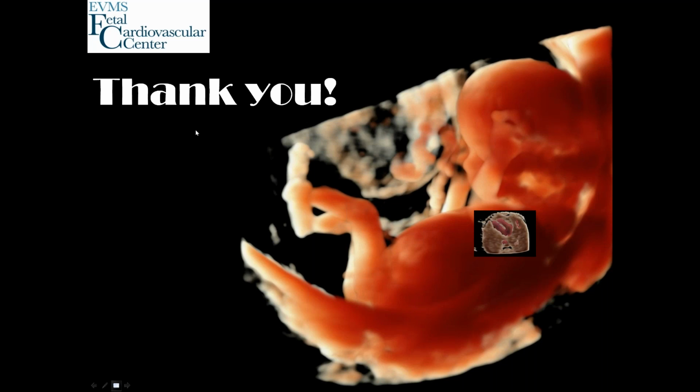Usually in the first trimester, I prefer to keep my PRF at about 2.5 or lower if I need to see the pulmonary veins, but you can go up to 3. After that, usually the image is not so sensitive and you don't see that much color to fill all the ventricles. So those are the presets that we are using. Usually the color Doppler preset fits for the four-chamber view and outflow tracts. You will use a slightly higher PRF, about 2.5 to 3, and for pulmonary veins visualization, you can go a little bit lower, as well as for the branches of the aorta, or if you're specifically looking for an aberrant right subclavian artery.